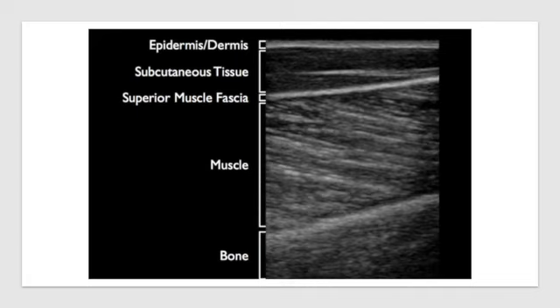Big thing to note here. Pause this slide and get to know this slide. When we're looking at a diagnostic ultrasound, the top of the image is going to be the most superficial layer, and then we're going to work superficial to deep. That is extremely important to know, because as we start looking at these structures, we have to understand that we're looking at a very small piece of a cross section.